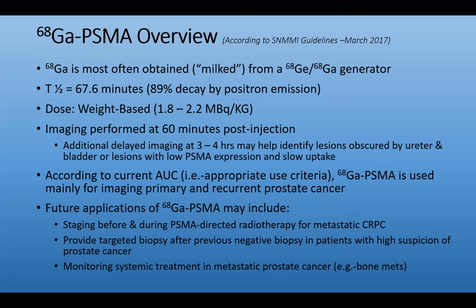And then another potential application would be for monitoring a systemic treatment in patients with metastatic prostate cancer. So looking for bone mets. So a similar application as how we use FDG, but remember that prostate cancer is not particularly FDG avid, but perhaps we can use gallium-68 PSMA instead.